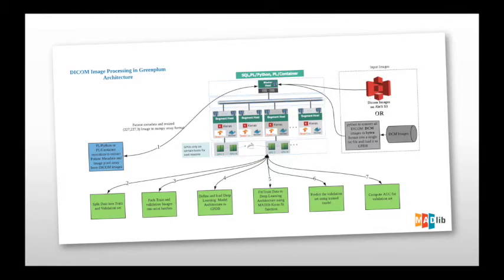So let's say you have the DCM images on the hard drive. Then you take these DCM images and convert them into byte array format. DICOM images come with the extension .dcm. You convert them to byte array format, write them to a single txt file, and then load it into Greenplum. The single txt file is loaded in a parallel way using Greenplum's native load command support.